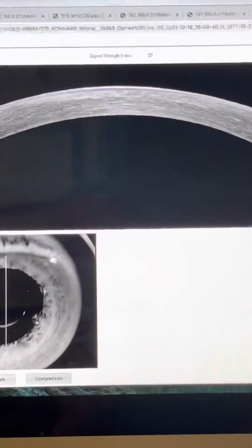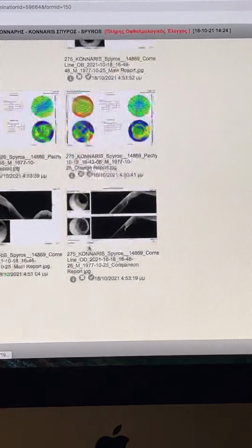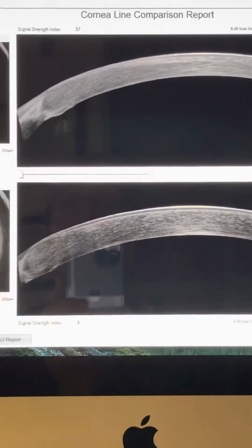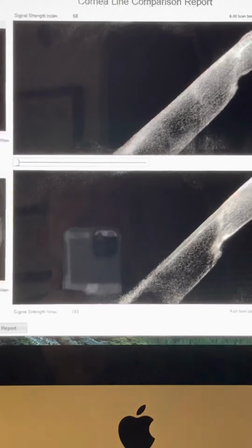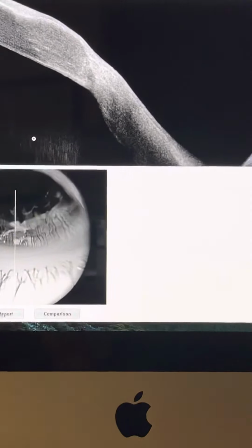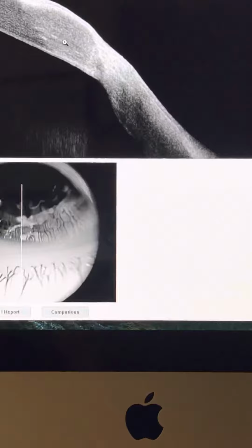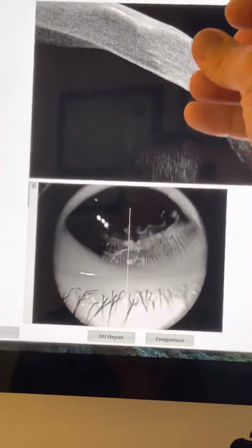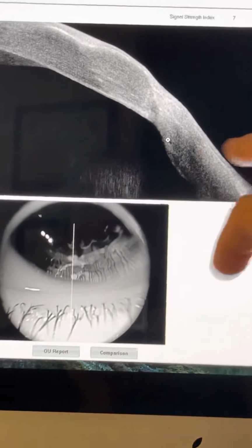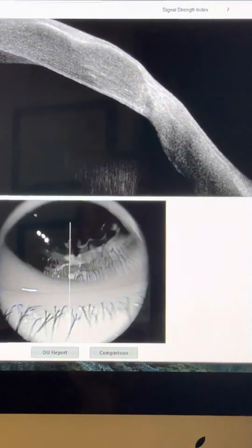This is the left eye that underwent PRK, and this is the right eye. I'm sorry, this is the left eye again. And we'll go and look at some images from the right eye, 9 o'clock position, and the most critical in the right eye, 6 o'clock position. You can see how after resuturing the graft-host interface, I have a better approximation, and we've reversed this stretching of the interface and the cross-linking. You can see it as hyperreflectivity, and the graft-host interface is able to stabilize that result.